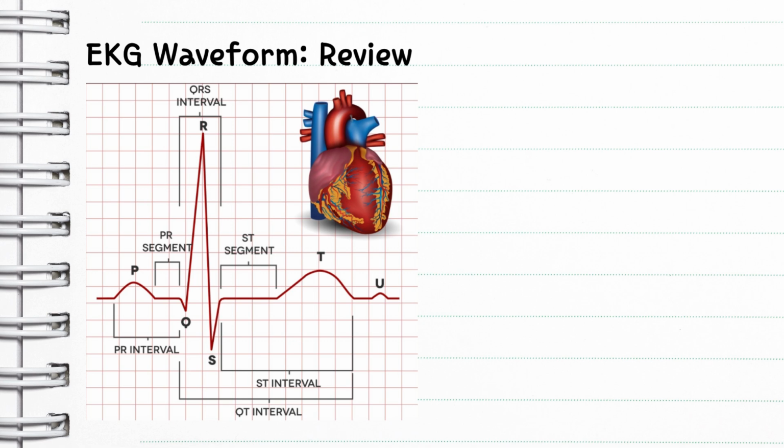Typically, depression is ischemia, elevation is infarction. Not always the case, but typically that kind of goes with it. So the T wave itself represents the ventricular repolarization. That's the process by which the ventricle is resting. It's no longer getting shocked by a piece of electricity and squeezing. It's now opening and relaxing and filling basically back up with blood, right?